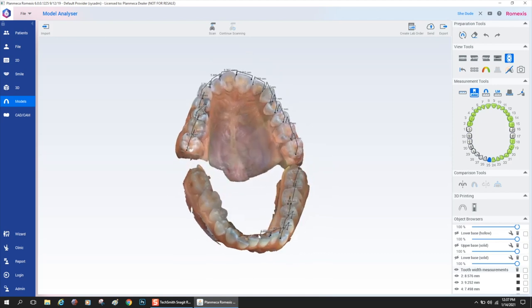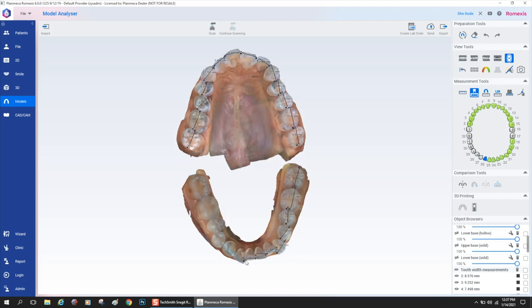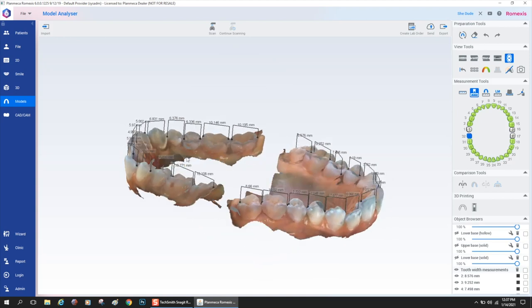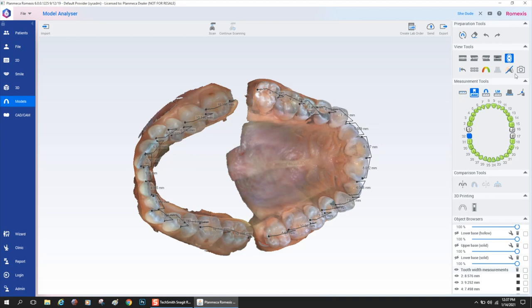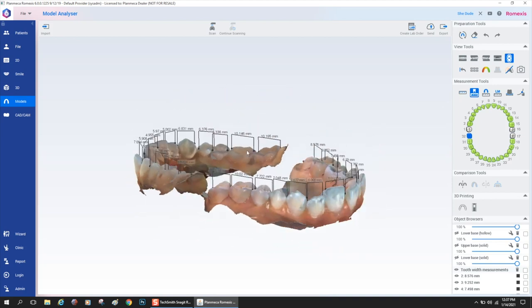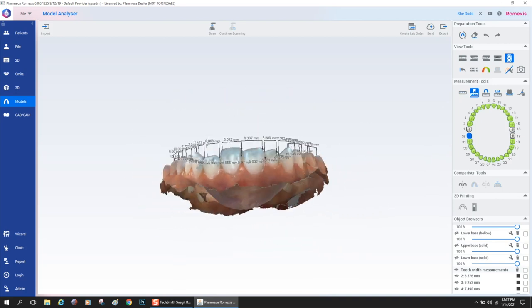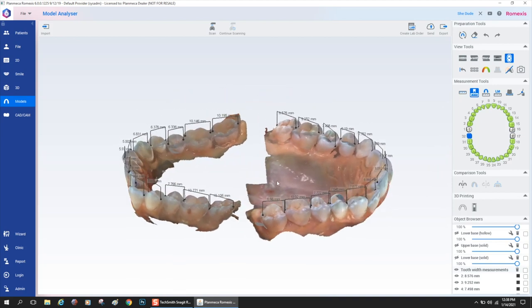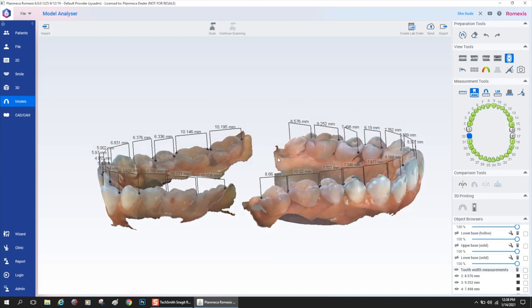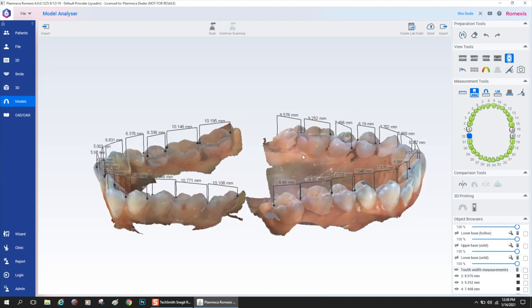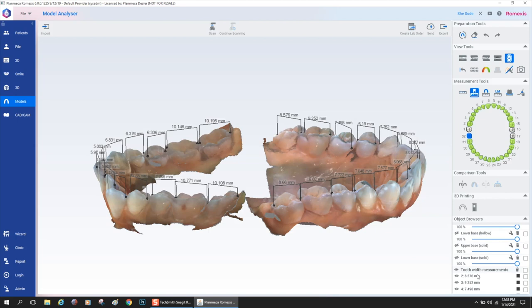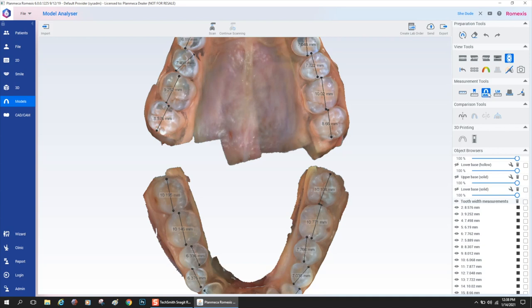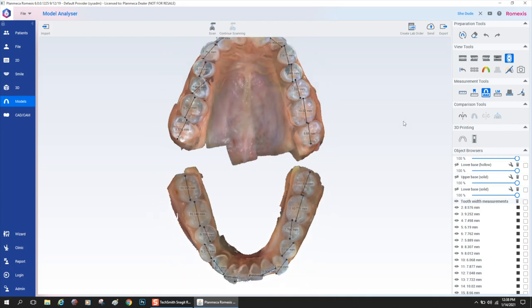This will come in important later when we look at arch size and compare the differences with discrepancy. Now I'm going to go down to the bottom and click number 18. Then I'm going to just power through measuring those on the lower. You could rotate the model at any given time during this measurement stage to get a better view of the mesial distal surfaces. You can see they hang out in space as it drops the skeleton in the air.